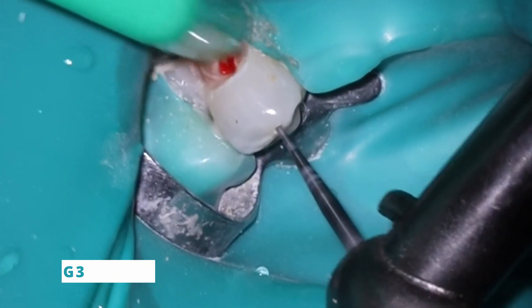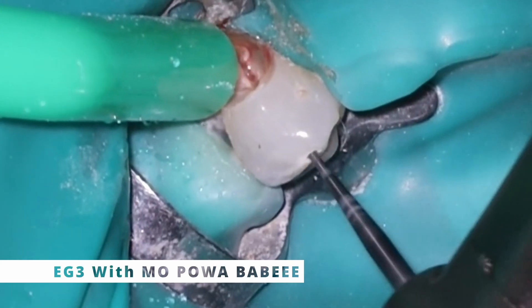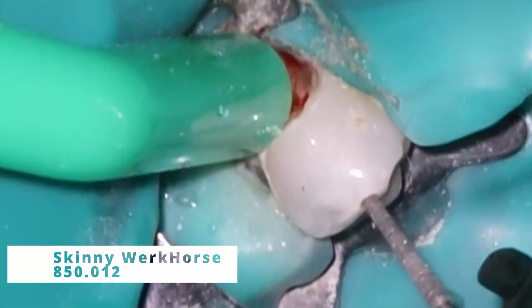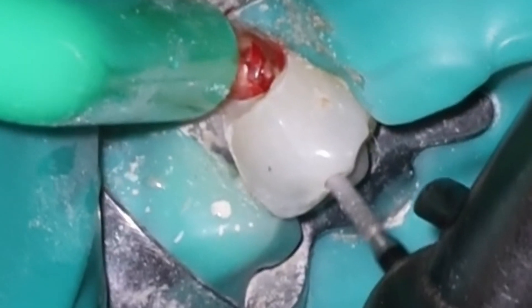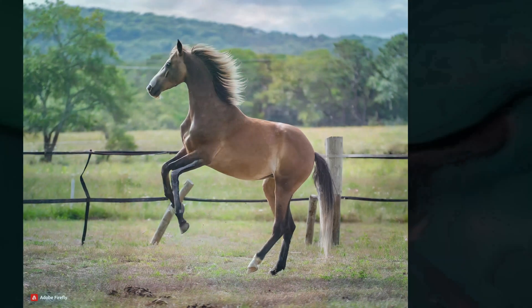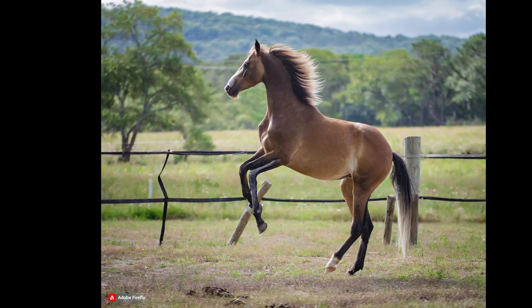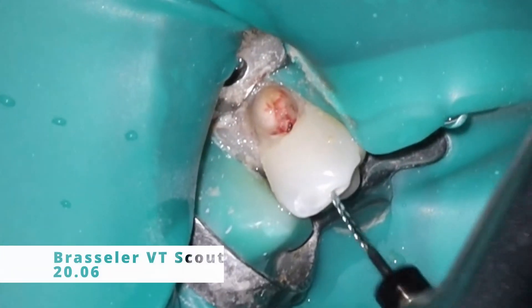Having a little bit of trouble with the air handpiece, so we get a little more power — switching to the electric handpiece, which dropped down beautifully. I'd also like to introduce a new file: we have a skinny workhorse here. I've started to switch from a 014 to a 012 — not that much of a difference. Here, by the way, is what AI thinks a skinny workhorse looks like as opposed to our normal one, a little bit smaller as you can see. With that direct line of access we're able to drop down nicely.